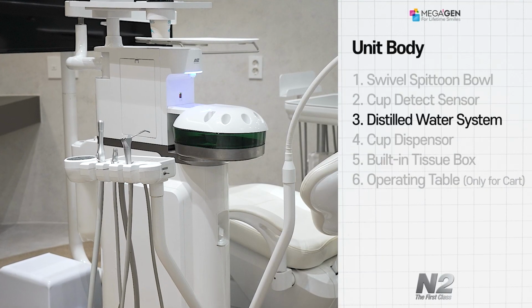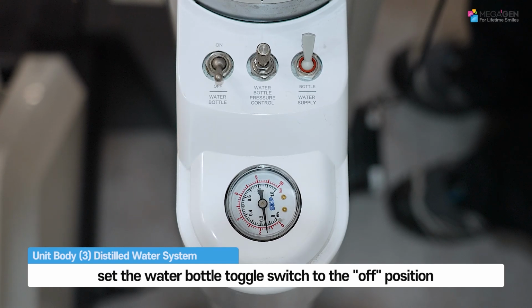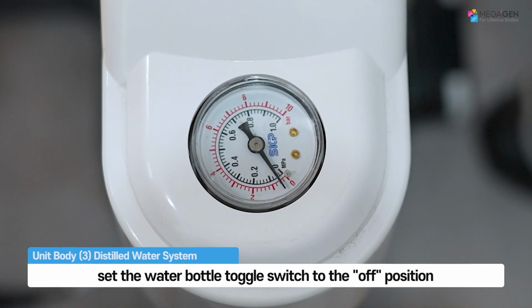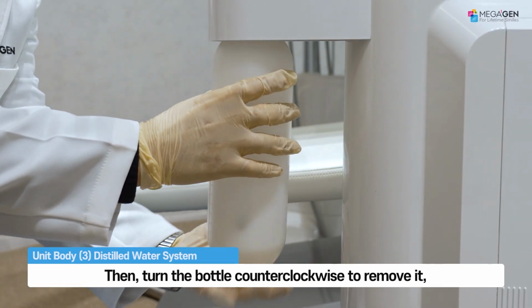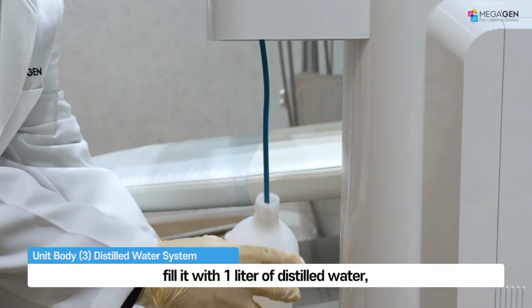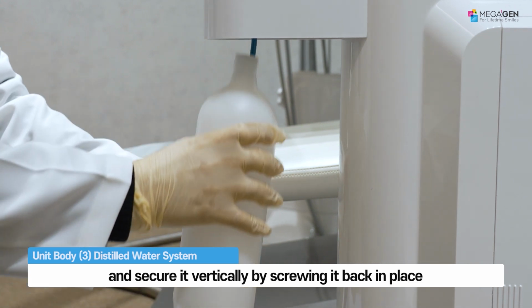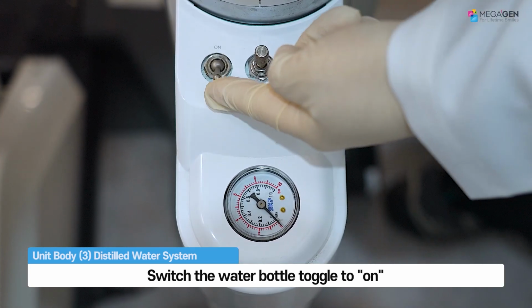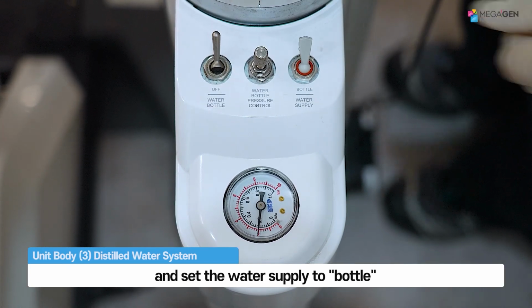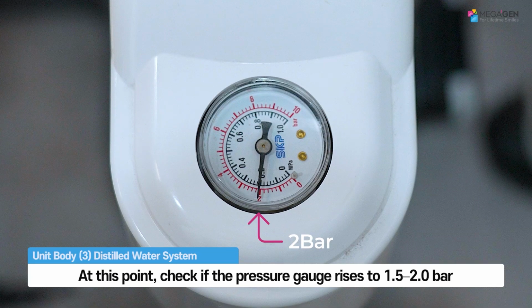How to use the distilled water bottle. Before removing the distilled water bottle, set the water bottle toggle switch to the off position and ensure the air pressure drops to 0. Then, turn the bottle counterclockwise to remove it. Fill it with 1 liter of distilled water and secure it vertically by screwing it back in place. Switch the water bottle toggle to on and set the water supply to bottle. At this point, check if the pressure gauge rises to 1.5 to 2.0 bar.